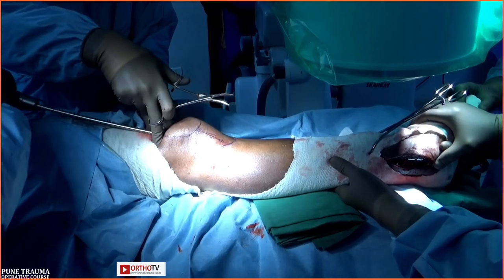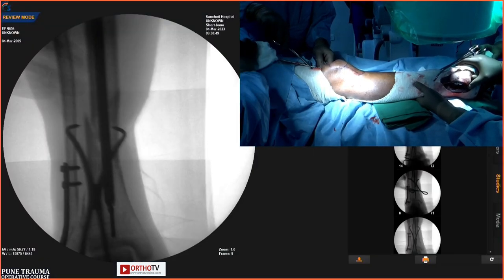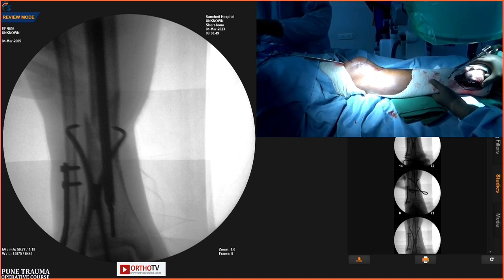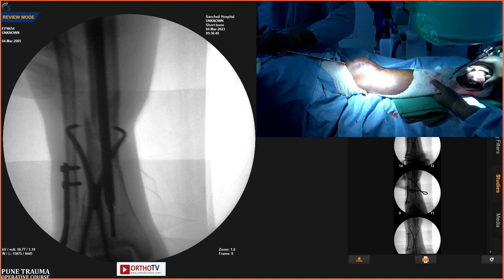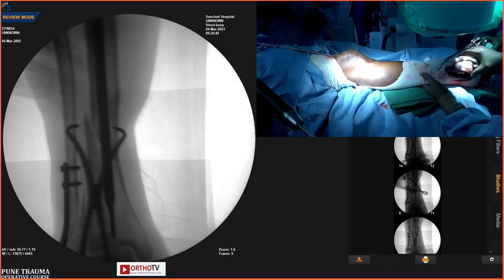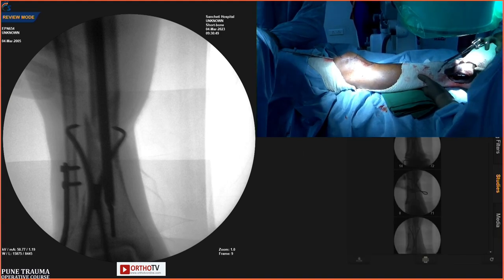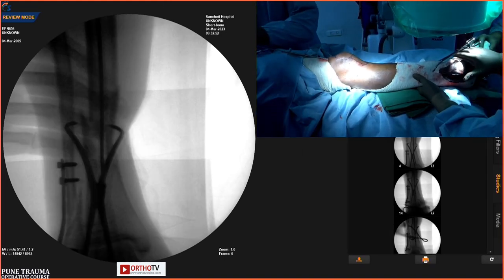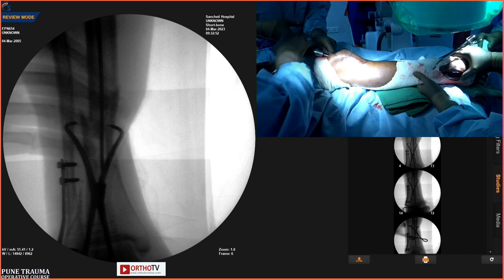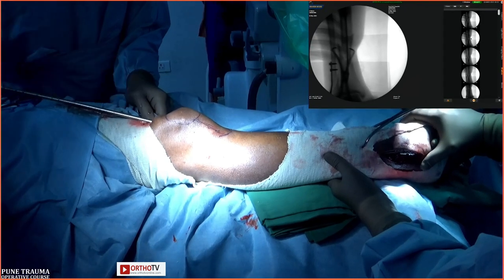So you are going to ream till 11 and put a 10 nail? Yes, sir. We will put the 10 nail; now it is 10 reaming, we will do 11. The canal is pretty capacious, you can go for 11 also. It's okay, there is no issue. Good nail reduction. This is the 10 size, if that goes very easily. Okay, sir, a little vibration now. Come, shoot.